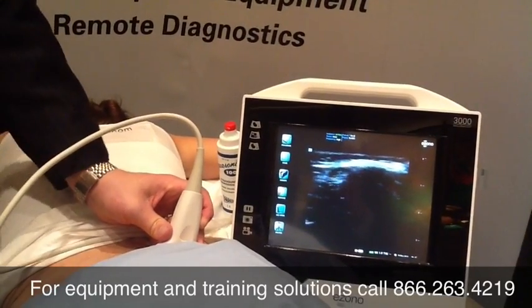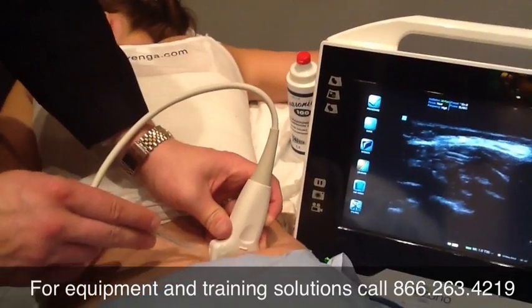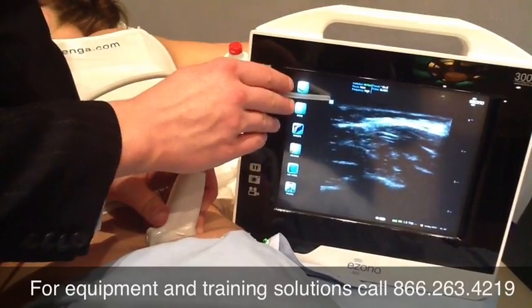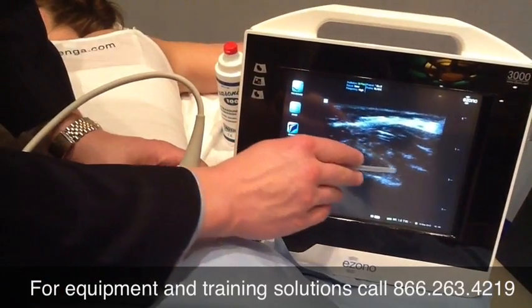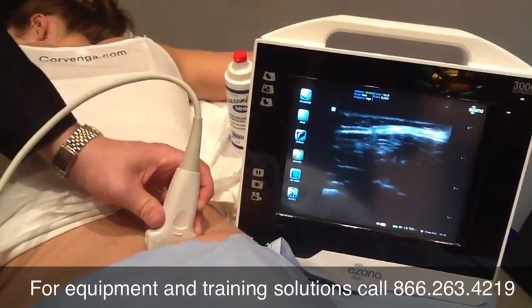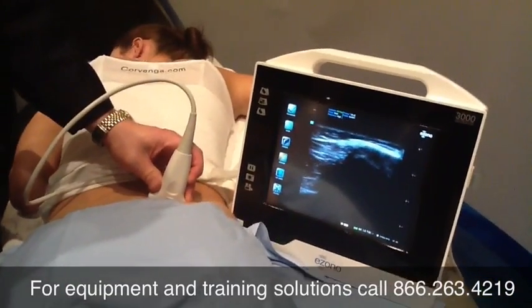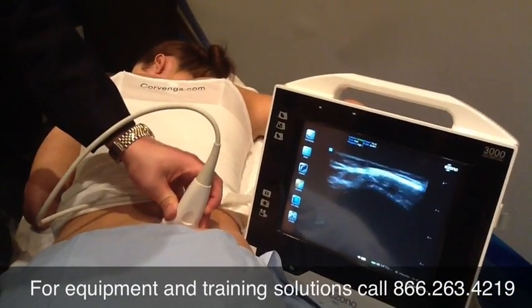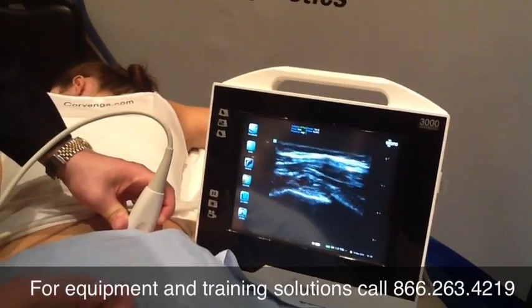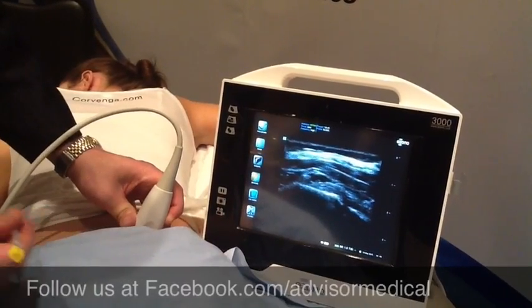The injection technique involves taking your needle and coming in medially, traveling lateral. You would be following your needle down the screen and into the SI joint. The second technique is to go just past that to the lower portion of the SI joint, following the joint right here.